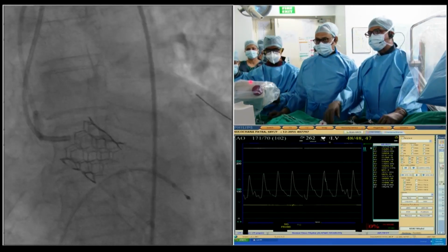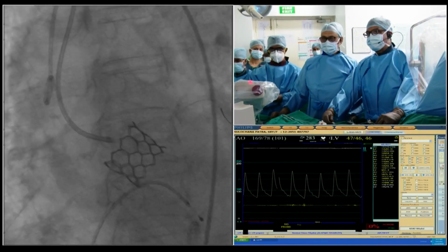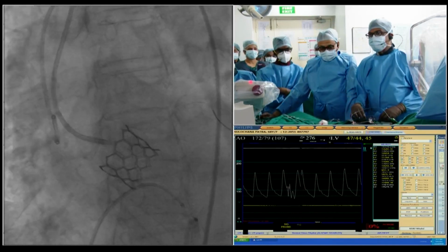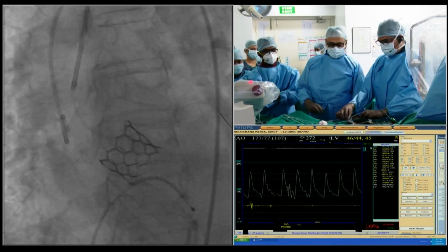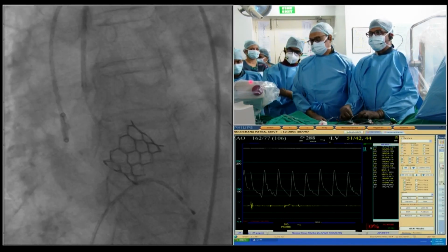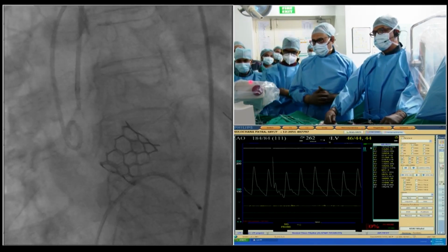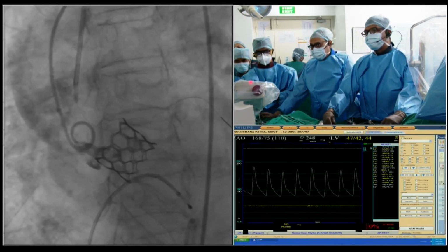Without stenting, right, because it may occlude. Yeah, even if you do IVUS, I agree IVUS might not give us a whole impression, because IVUS can only help us in defining the diameter of the left main. Other than that, it's not going to help us. Right, exactly. It can show the leaflets also. Yes, we understand that. Anil, we must remember there is also late coronary thrombosis with this leaflet across.